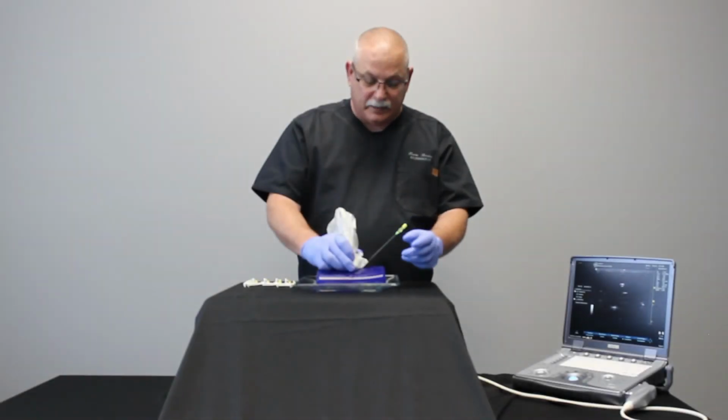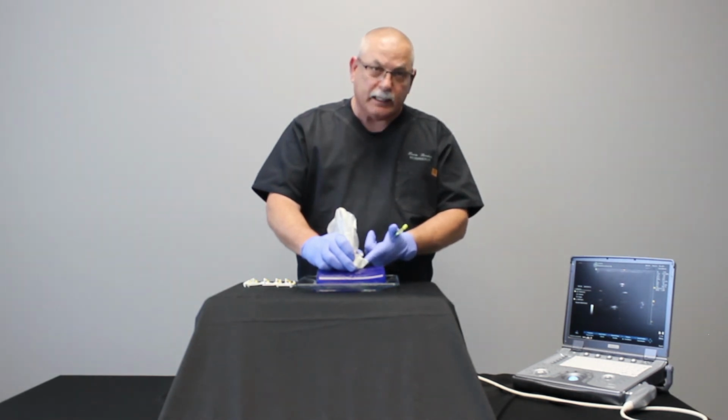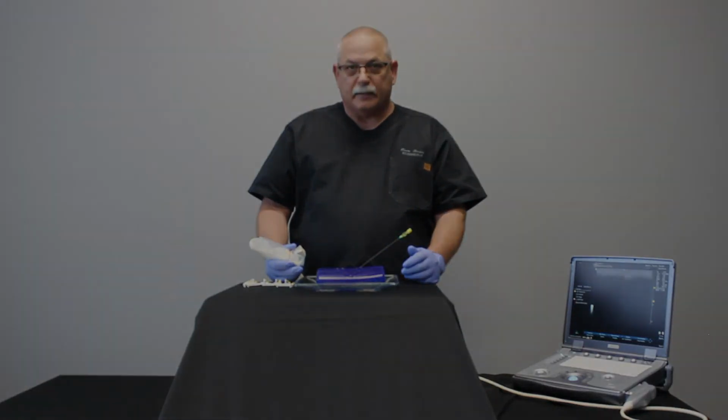Once the needle's in place, if I want to remove the probe from the field, I just push the quick release tab on the side of the guide. Then I can remove the transducer and the needle stays in place.